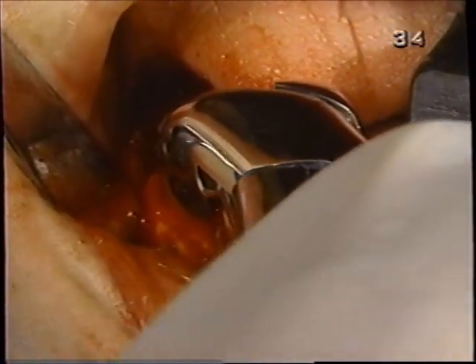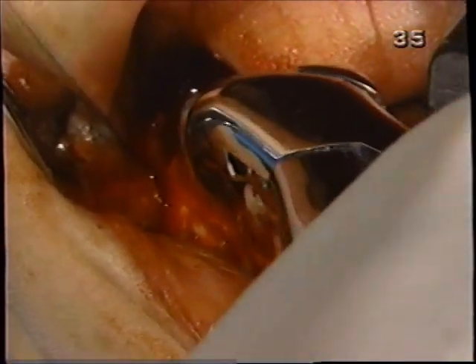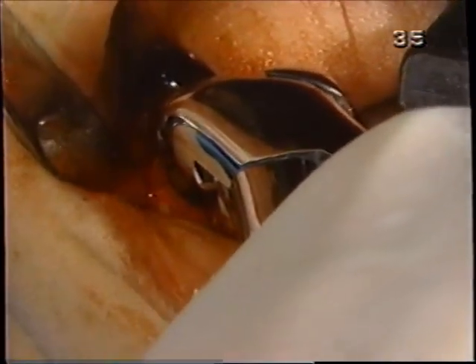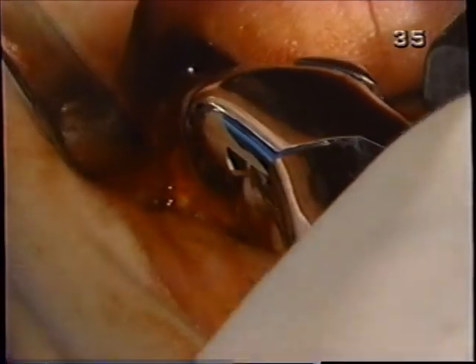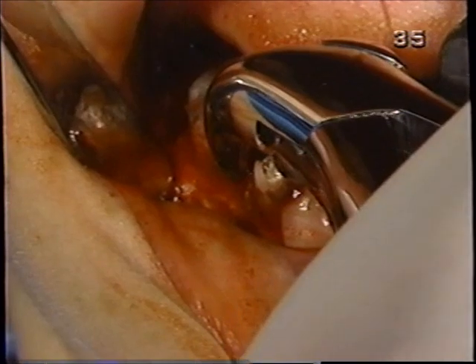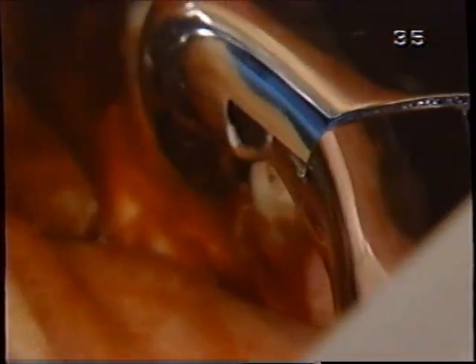But even though it is breaking, while it's not broken yet, let's take advantage of this moment and luxate while we can. Now, by luxate, we're doing some rotational and some buccal and lingual. In fact, as we go back and forth, not quick motions, although sometimes we'll do that, but more extended motions, like for 5 seconds or so. What we're doing is expanding bone, disrupting the ligament, and again some rotation.